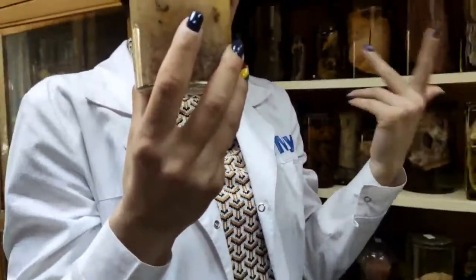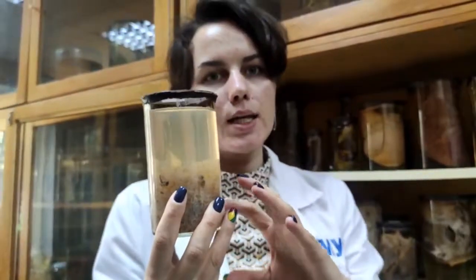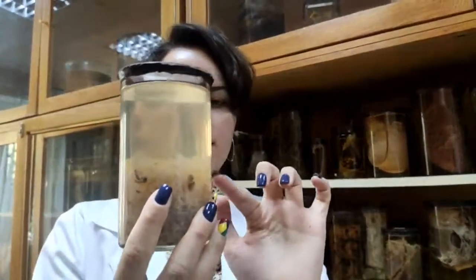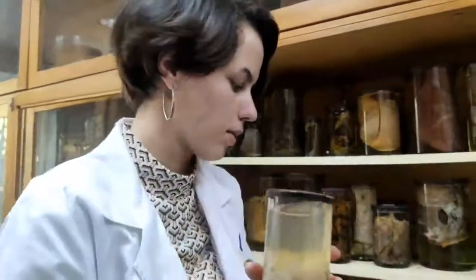It can grow into the wall of the uterus. In this case, we call it invasive hydatidiform mole, and sometimes it can spread in a hematogenous way all over the body. And if these small particles become a malignant tumor, this malignant tumor is called choriocarcinoma because it's developed from chorionic epithelium.